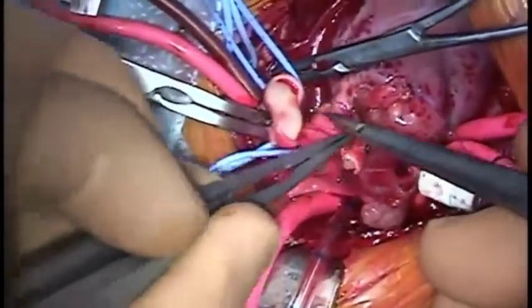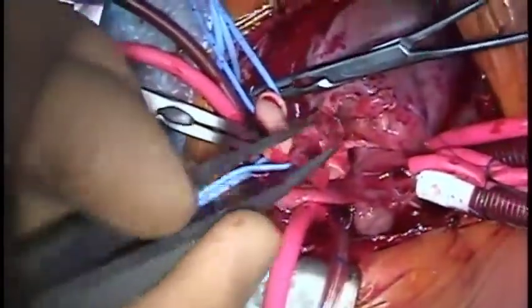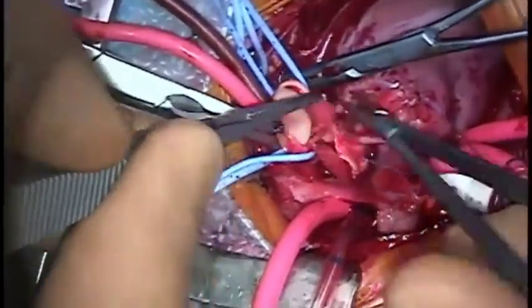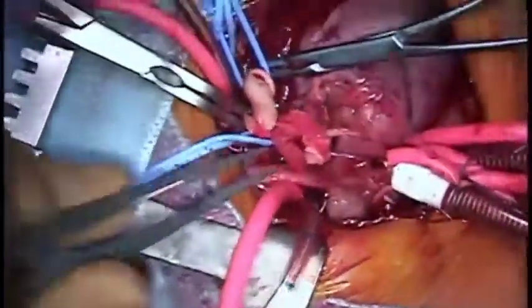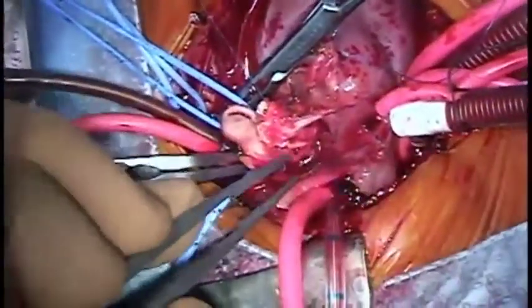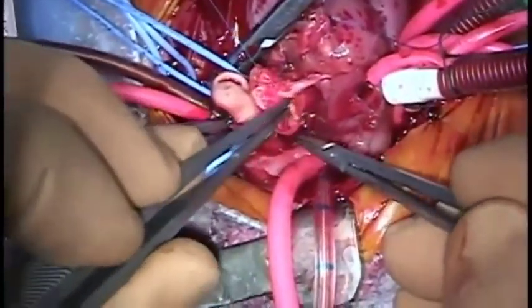Having completed the coronary implantation, the final part of the aortic reconstruction is completed by anastomosing the inferior margin of the patch to the neoaorta. In this view, the patch looks slightly redundant, however, remember the disproportion between the size of the great vessels. The suture line is completed in stages from left and right in order to keep the anastomosis balanced.